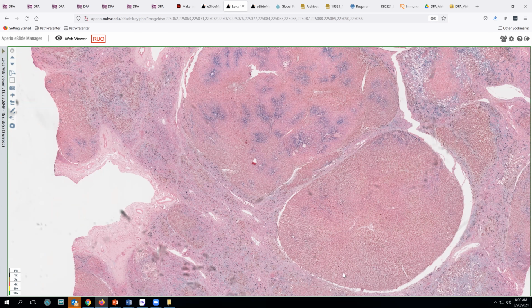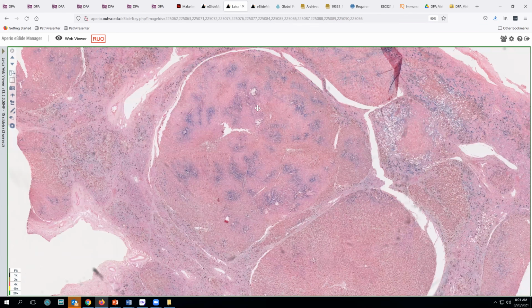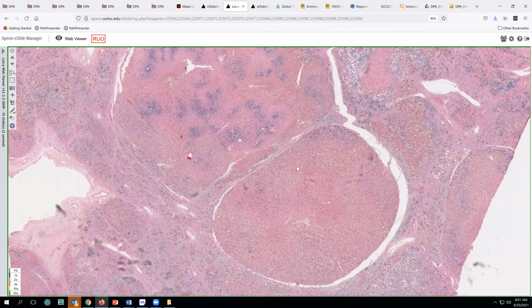Now, the other feature here that I want to call out is that these regenerative nodules have less iron in them than the surrounding parenchyma. And that's because as these nodules grow, they proliferate without the ongoing deposition of iron to the same degree. However, one question that then arises is, are these becoming neoplastic? Are they dysplastic nodules? Are these incipient hepatocellular carcinomas? Because patients with hemochromatosis can also develop that feature.